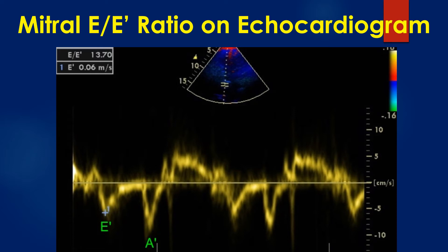It may be noted that the Nyquist limit for the color tissue Doppler is 0.16 m/s in this image, while it is 0.65 m/s in the following image for color Doppler imaging. This is because blood flow velocities are much higher than the velocity of tissue movement during systole and diastole.